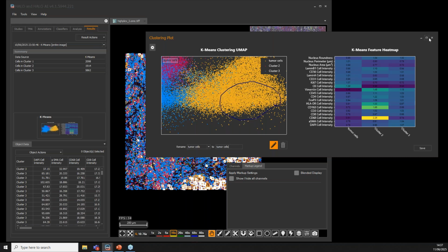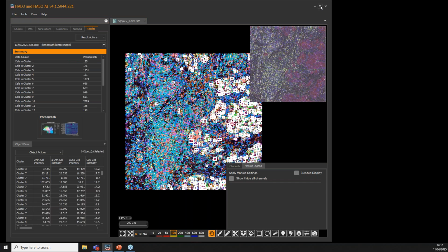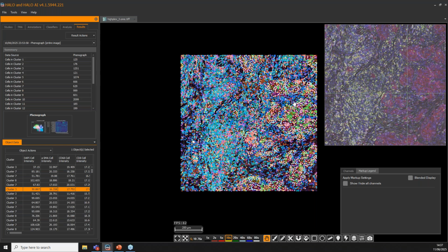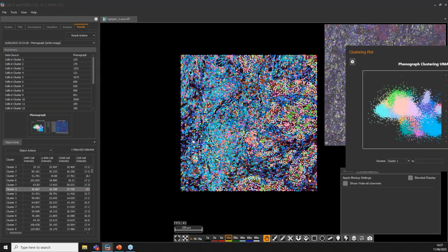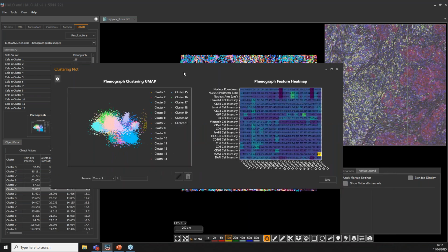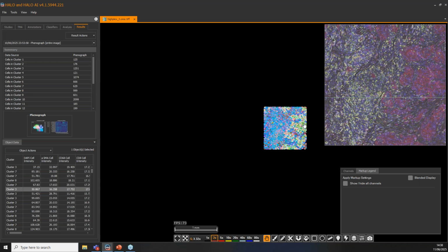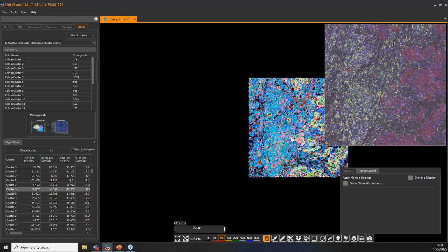All right, so now that I've shown the k-means, I just wanted to check really quickly the phenograph, just so you see that there are different methodologies and they look a little bit different. So here you see that we have many more colors, because what phenograph does is actually to find the clusters itself. So before I decided on 3 clusters because I was expecting to have tumor, stroma, and immune cells, but in fact you do have subpopulations that may be interesting for data exploration for your experiment here. And actually, even just in the tumor itself, it seems that there are subpopulations that may be of interest here. They may not be reacting all the same way.